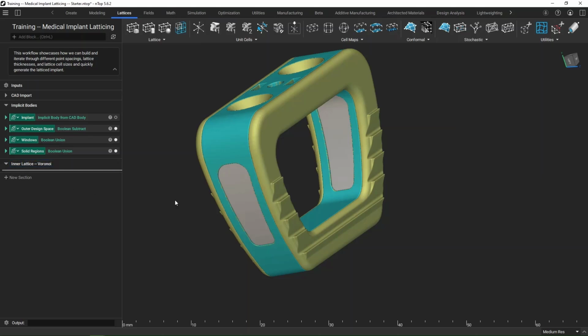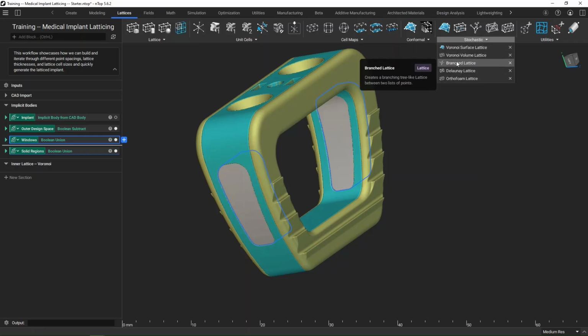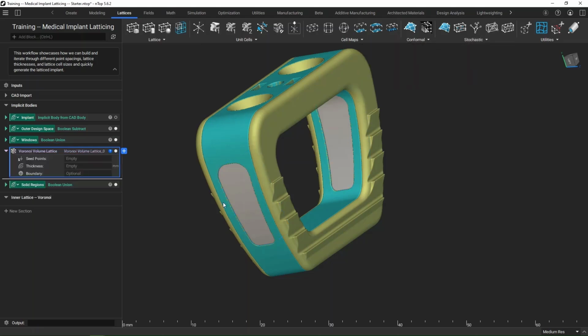And so perhaps you're starting to get familiar with working in nTop. I can add in new blocks by using the search bar up here. I can also use the ribbon too. So I'll do a combo of that just as you're continuing to explore and get used to the user interface of nTop. But what I want is a Voronoi volume lattice. I know I'm filling these 2 windows with a Voronoi. And so if I go over to the stochastic area right here, we see we have a couple of different options that we can work with. But that Voronoi volume lattice is going to be what's going to fill that entire region here. I'll drag that back down to the section that we're working in.